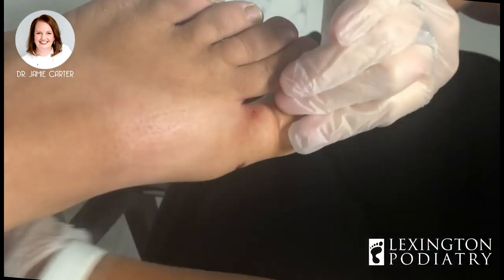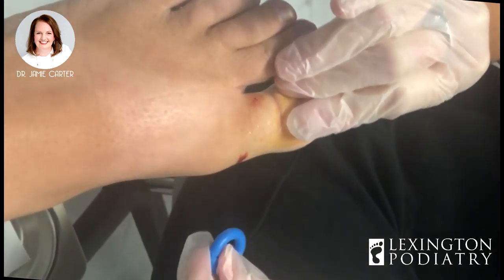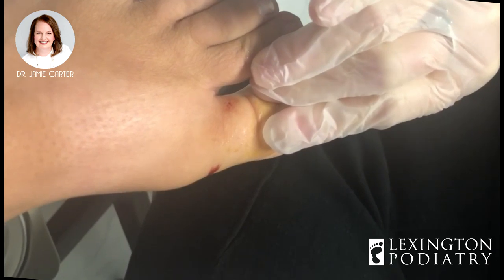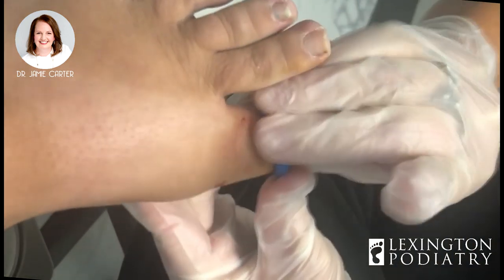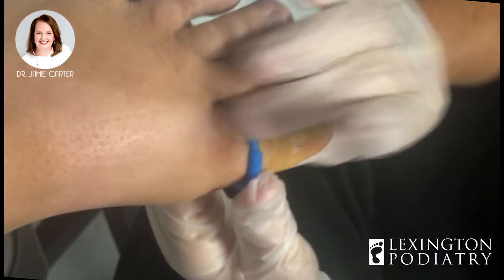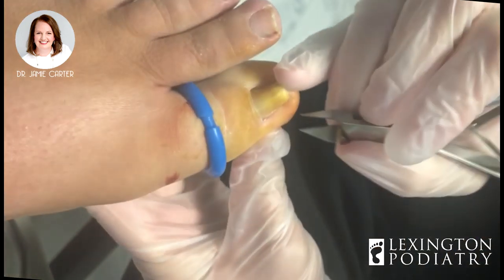So at this point we put betadine on the toe to clean it up. I use a tourniquet always for this because I feel like I can see better, and I feel like it also helps the chemical to work. If there's blood going everywhere, I feel like it may neutralize the medicine and I don't want to take any chances. Different doctors definitely have different opinions on that.